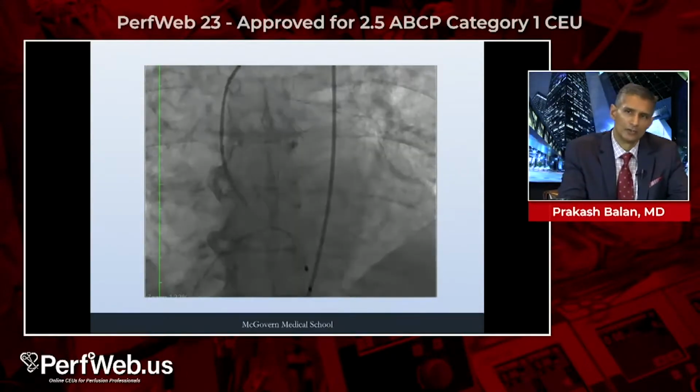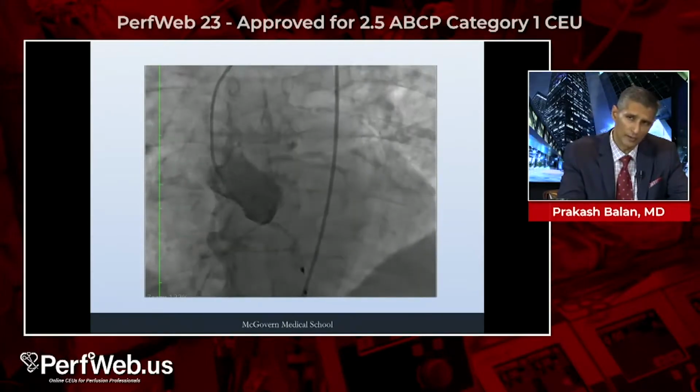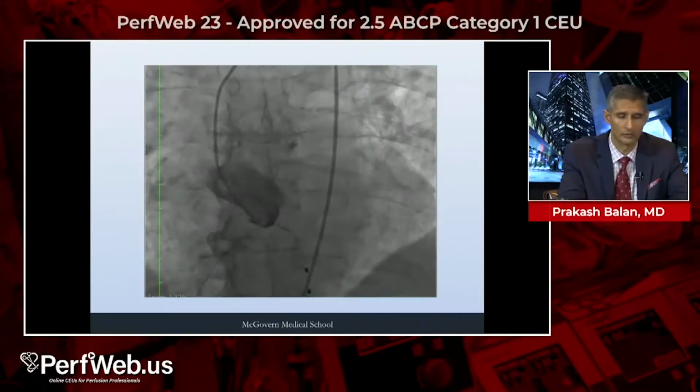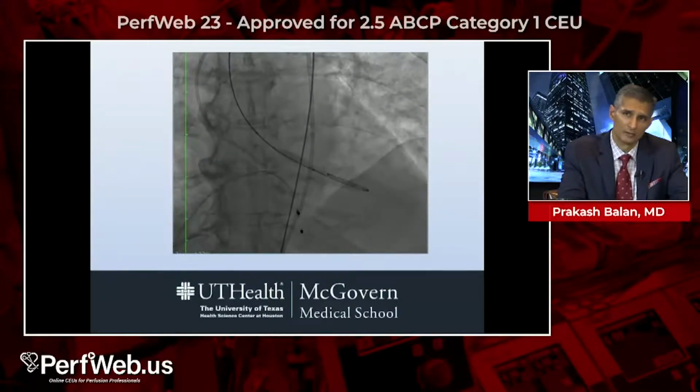Here you see the original aortogram at the start of the procedure. She has clean coronaries. However, you notice the right has a particularly high anterior takeoff, the right coronary artery there. The valve turned out to be quite a bit tighter than we anticipated.